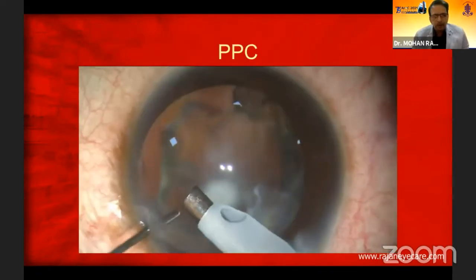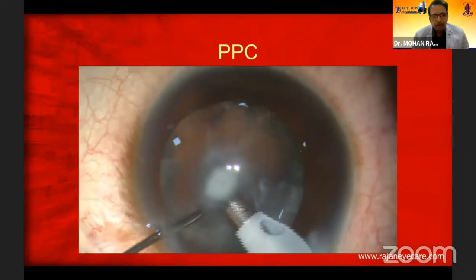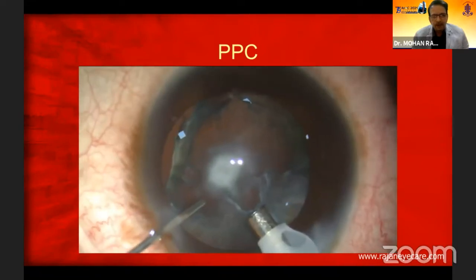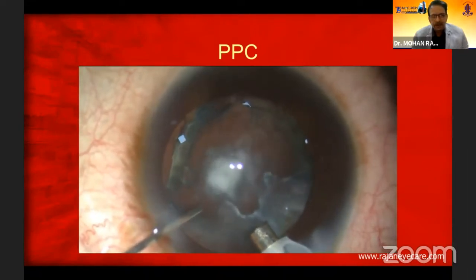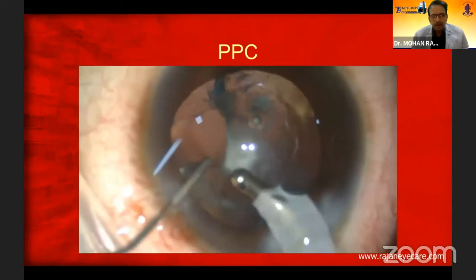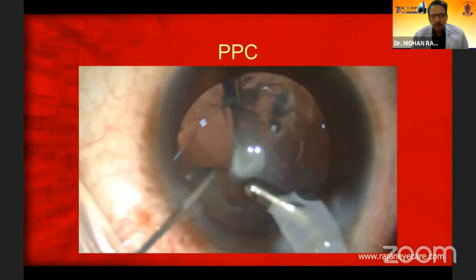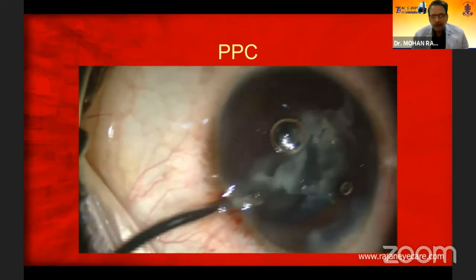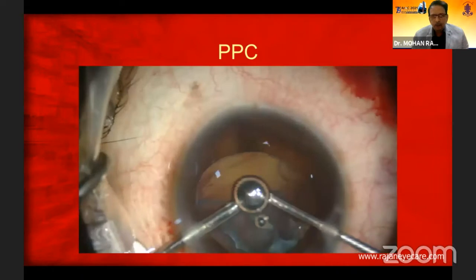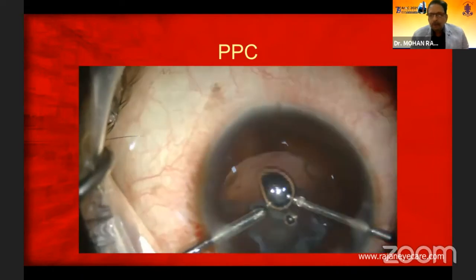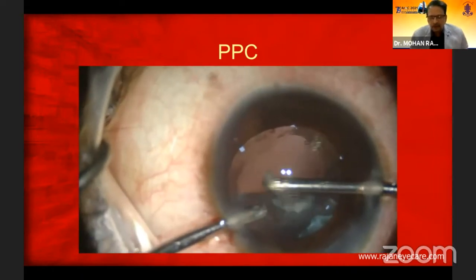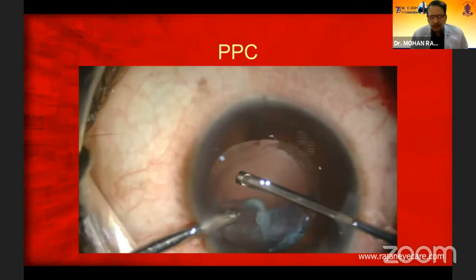Here I'm trying to go after the nucleus in a posterior polar cataract. There is a PC tear with sudden deepening of the anterior and posterior chamber. I'm injecting viscoat there and coming out, immediately creating a right side port. Put triamcinolone there to identify the presence or absence of vitreous in the anterior chamber.